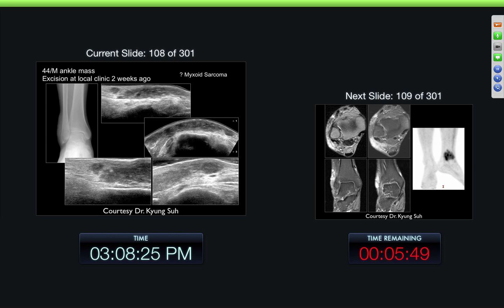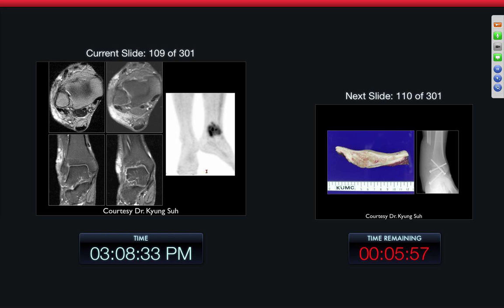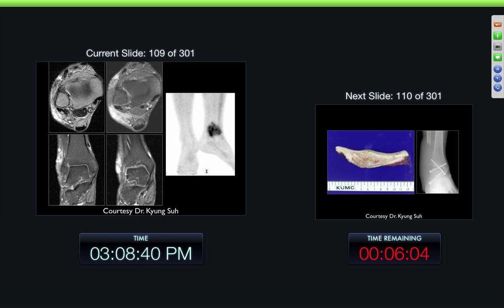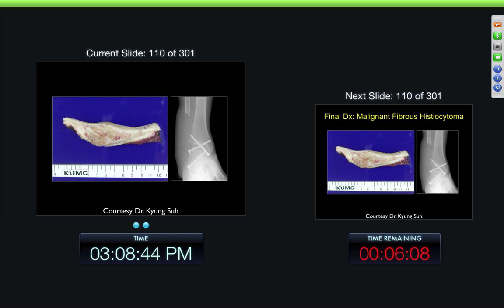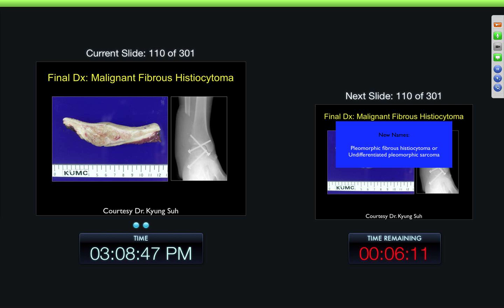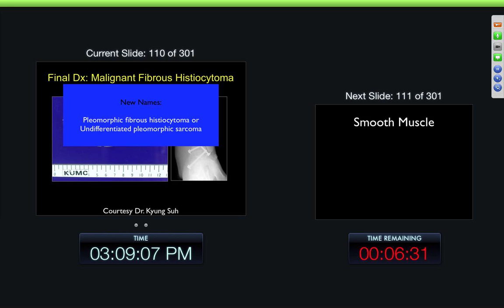44-year-old male with ankle mass, excised at an outside clinic. We can see some soft tissue swelling on the ultrasound, a diffuse mass within the soft tissues with uptake on the PET scan. They went in and did a distal resection — this was a malignant fibrous histiocytoma. There are a lot of changes in the nomenclature for these. Some people don't use this term anymore, but in older individuals it's one of the most common soft tissue tumors. New names include pleomorphic fibrous histiocytoma or undifferentiated pleomorphic sarcoma, but most people still use the older term, malignant fibrous histiocytoma.